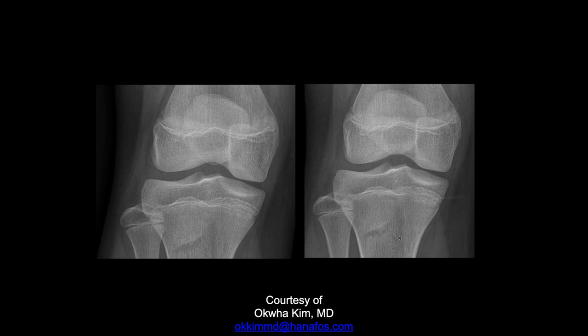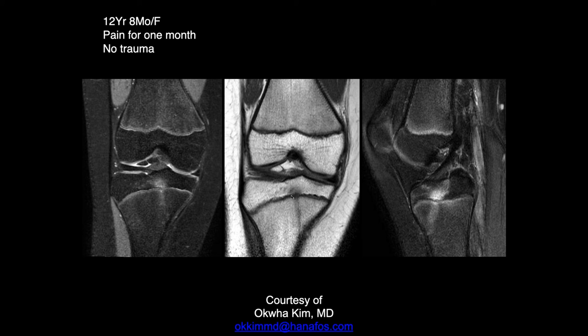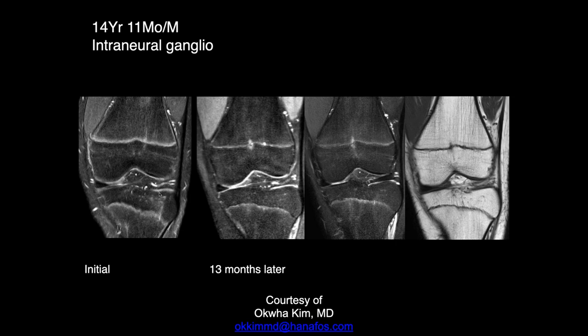Are you talking about this? Yes, I was concerned about that. And I think we're just viewing one side here. So the primary thing here is these little focal areas of edema here in the physis. I'm not sure what this is. It's not a fracture. These things can kind of come and go, and they tend to be right around the time of initiation of closure of the physis.